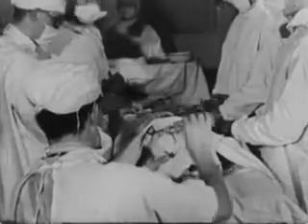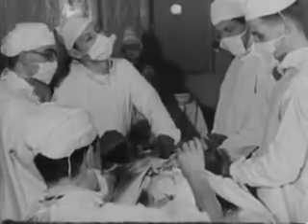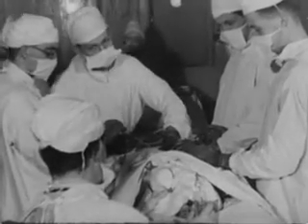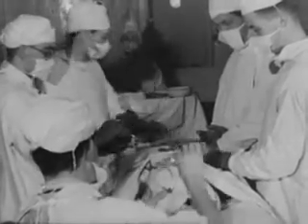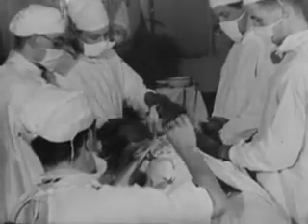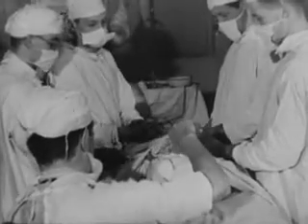This patient is in light anesthesia with eyes moving. The anesthesia is too light for the degree of surgical stimulus and stridor develops. The operation must be stopped until the stridor has passed off and anesthesia has been deepened. If you allow the stridor to persist, you will find it very difficult to get good muscular relaxation.